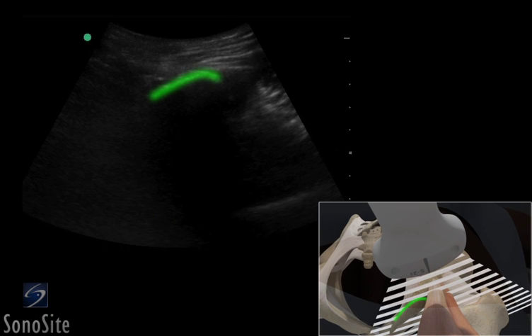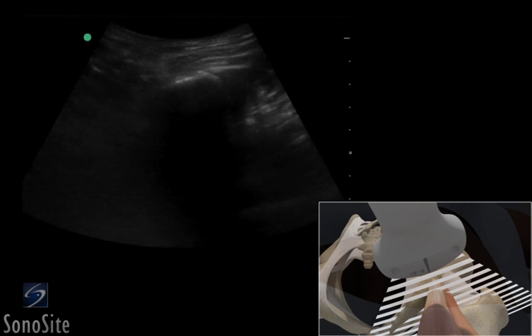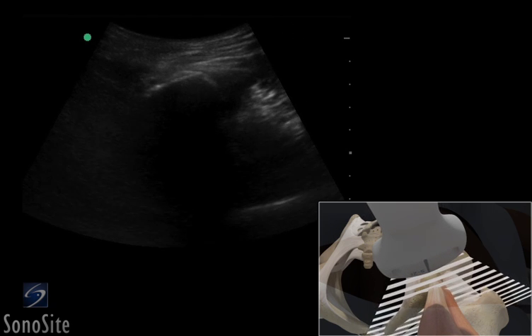The ischial tuberosity is seen as a bright, hyperechoic, curved structure. The hamstring muscle and its conjoined tendon is seen on cross-section in the mid-portion of the scan field. The transducer is translated superiorly to see the origin of the muscle in a short-axis plane.